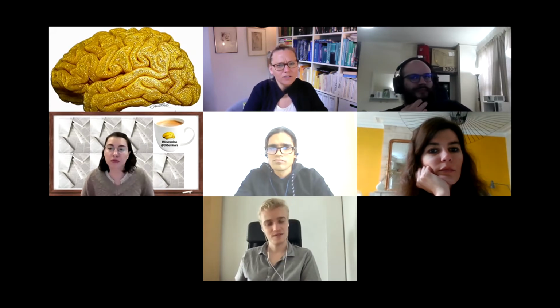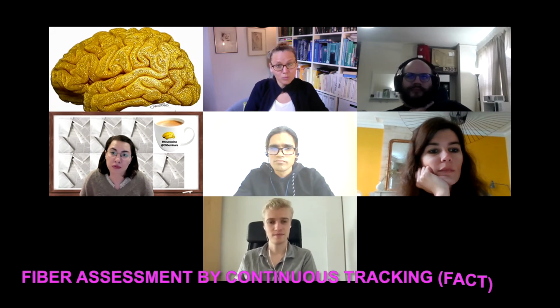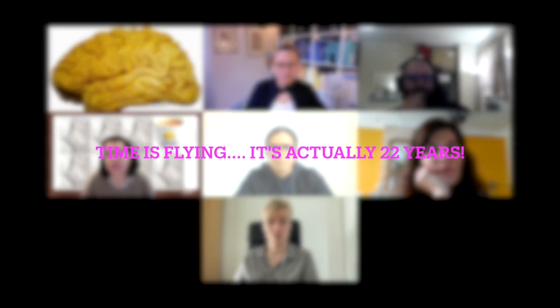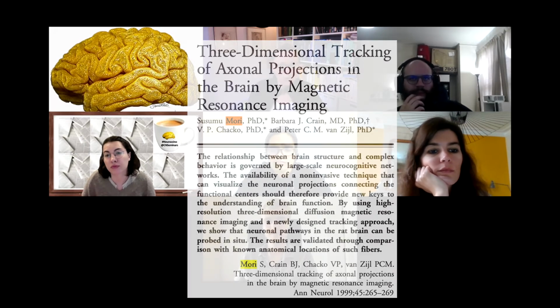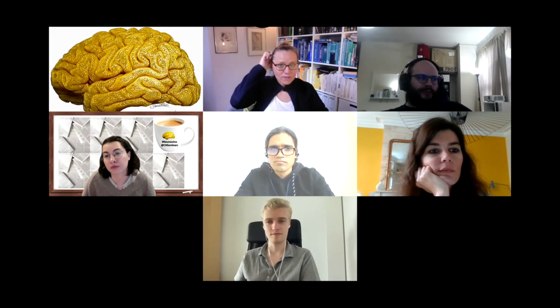So to the best of my knowledge, for tractography, for example, or diffusion imaging, the only algorithm that is approved in the clinic is the FACT algorithm, that is now 10, 15 years old, at least. And in terms of research, we moved on from that quite a while ago, but in the clinic it's still a commonly used algorithm. And it's often okay because the data that is acquired doesn't have 100, whatever, many directions. They have 6 directions or 25 directions, right? So it serves the data better than what we're doing.